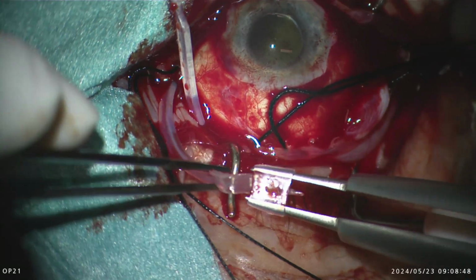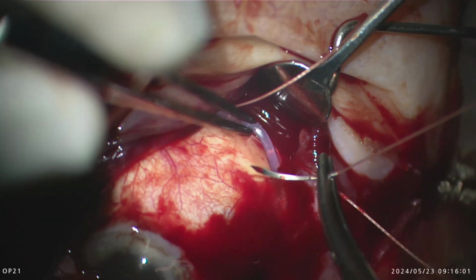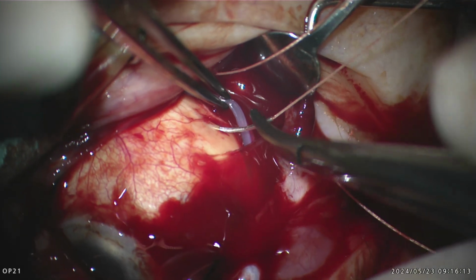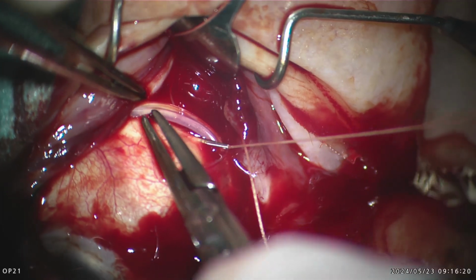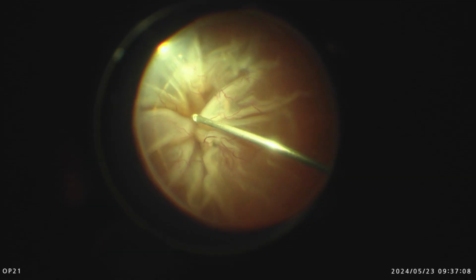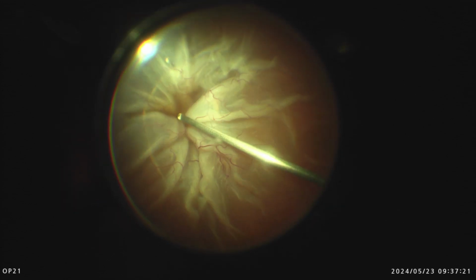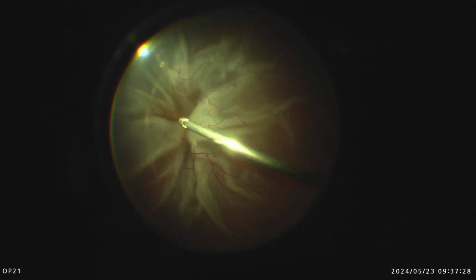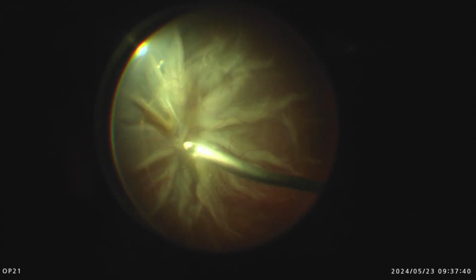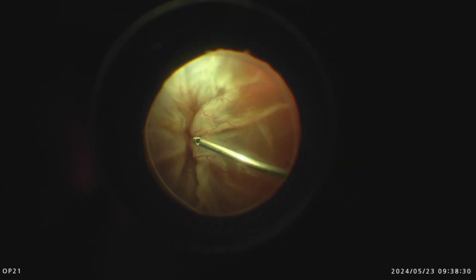This is a case of a patient who had a long-standing retinal detachment, which on ultrasound was evidently funnel-shaped. In these cases, I do employ an encircling band, or cerclage as we call it. And as you see here, there is an attached posterior hyaloid, most likely or at least partly attached, as well as a ring of subretinal PVR, which is usually more common in these long-standing cases.